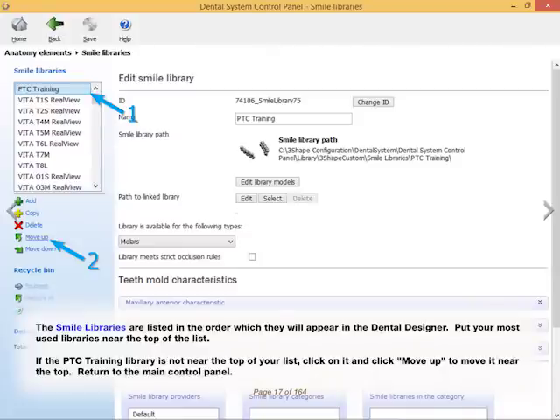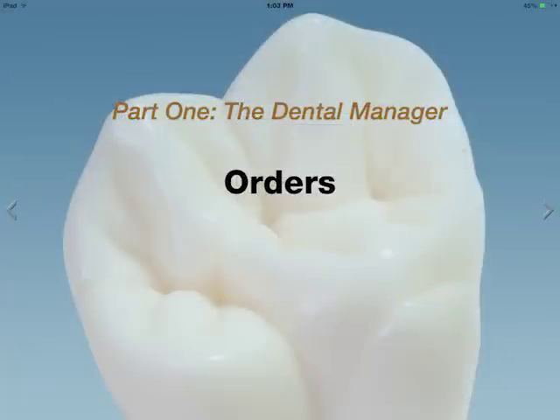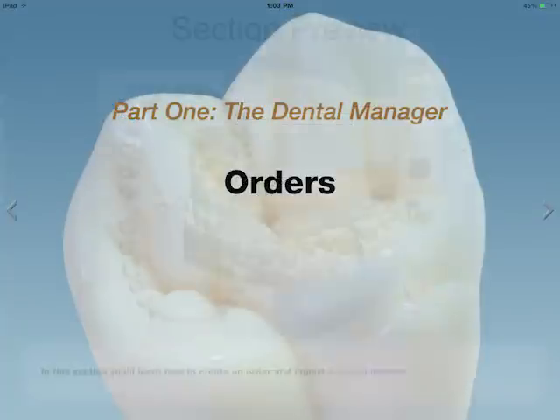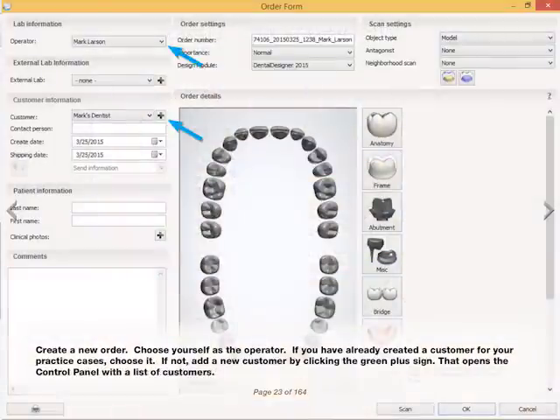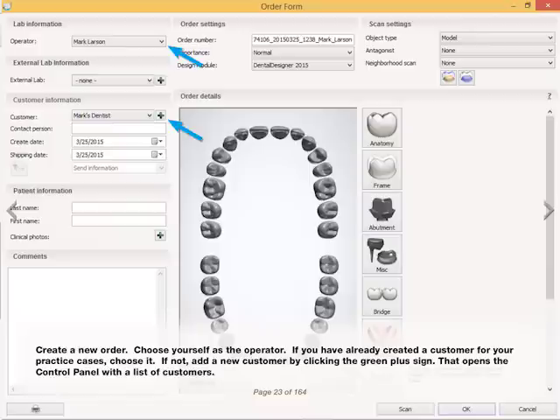Return to the Main Control Panel. In this section, you'll learn how to create an order and import scanned models. Create a new order and choose yourself as the operator. If you have already created a customer for your practice cases, choose it. If not, add a new customer by clicking the green plus sign.